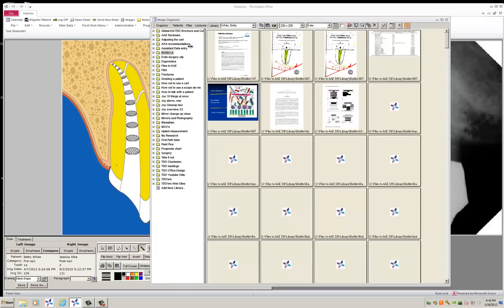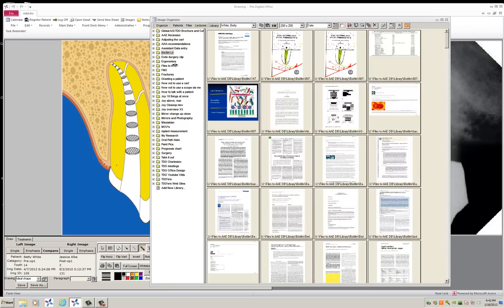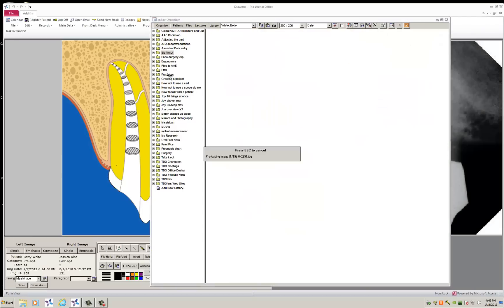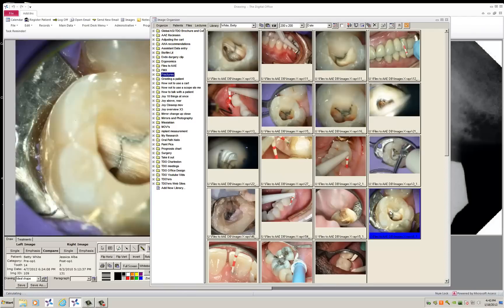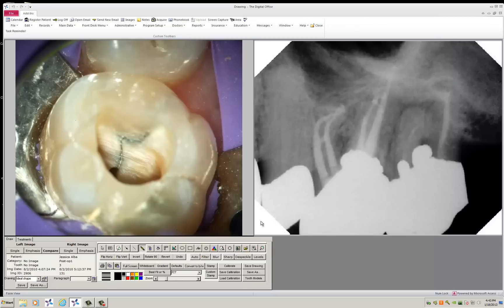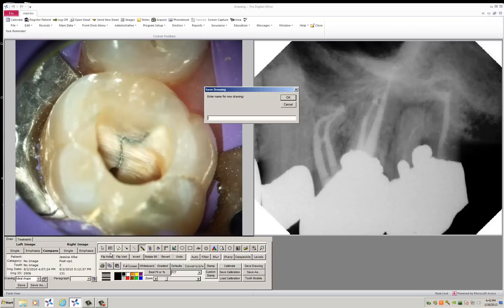I go to my library because I know I've saved some things with fractures. Here's a fracture picture. I double click on it. It loads the fracture picture. Now I'm going to save that fracture picture as fracture one.